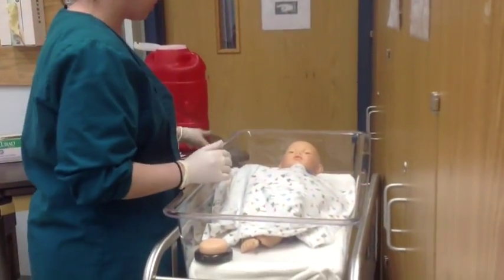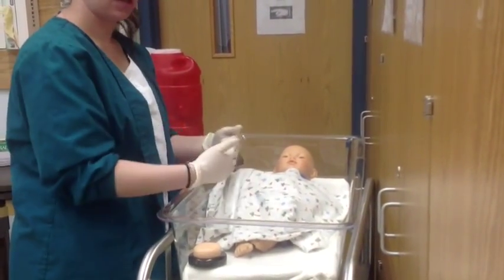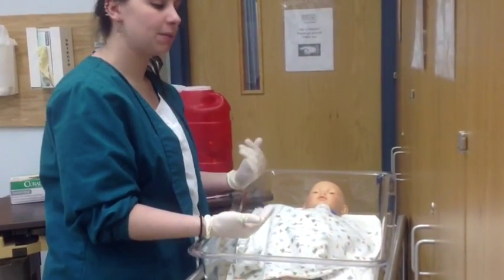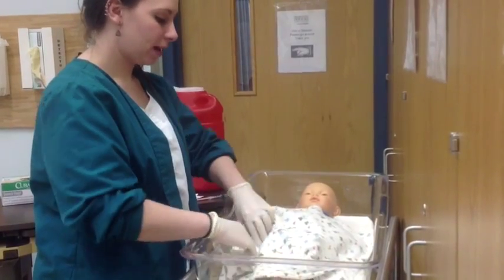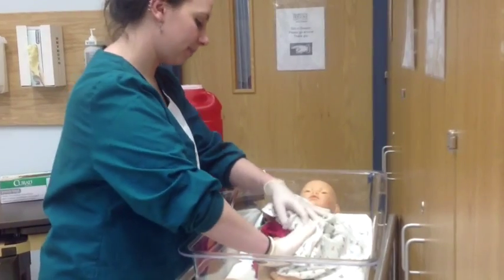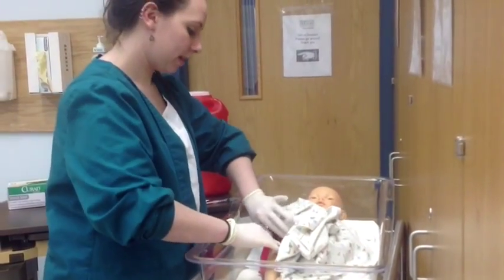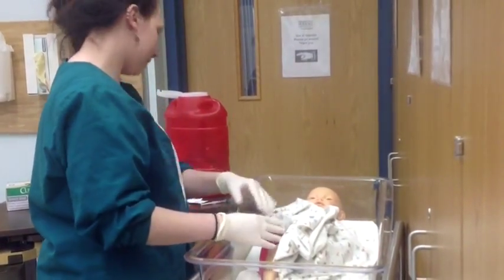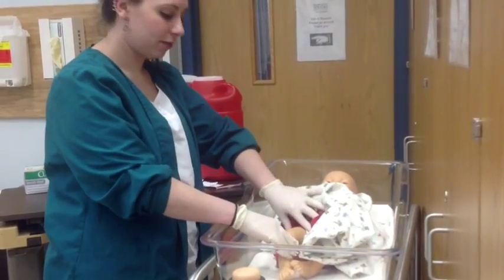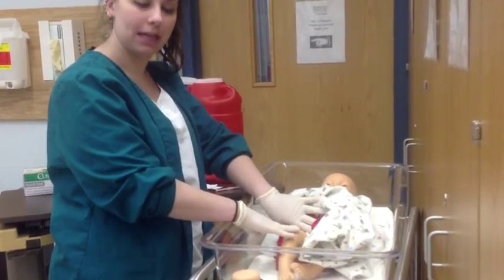Okay. So some facilities have different legs that they do the shots in based on what the baby's prescribed. Vitamin K and hepatitis B don't want the same leg. So for today, I'm going to give the injection on the baby's right vastus lateralis. I'm going to show you how to mark it out. I'm not going to really inject the actual baby because it's a mannequin, so we're going to use a fake one.